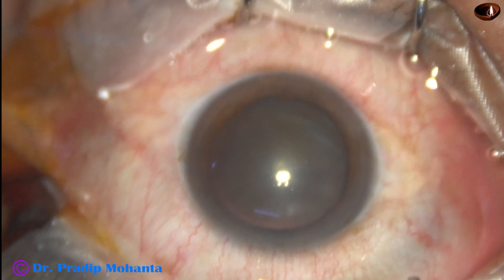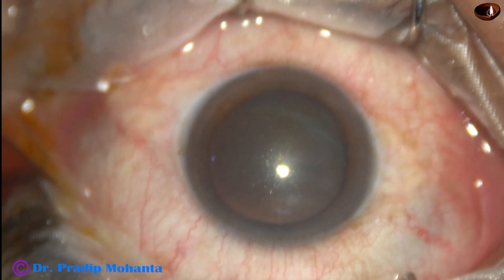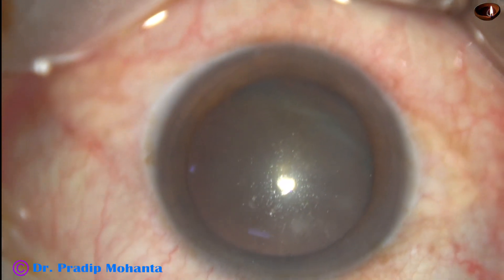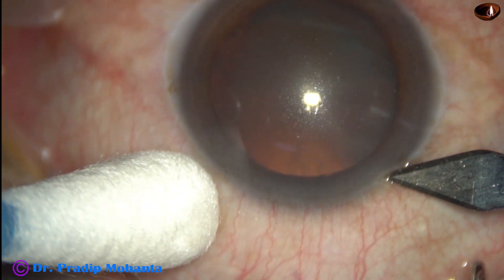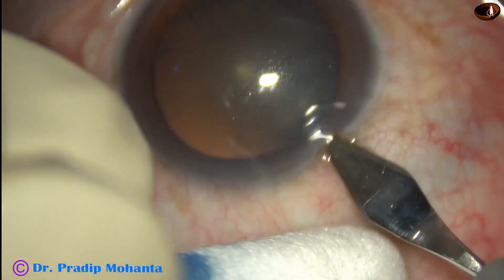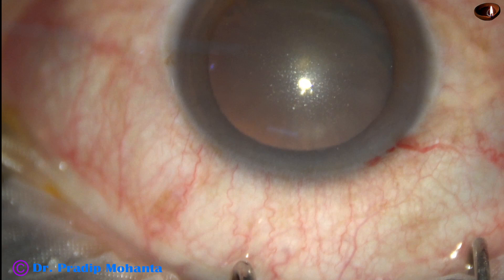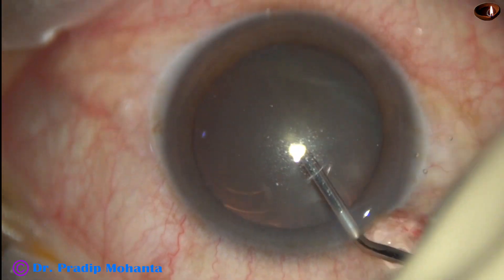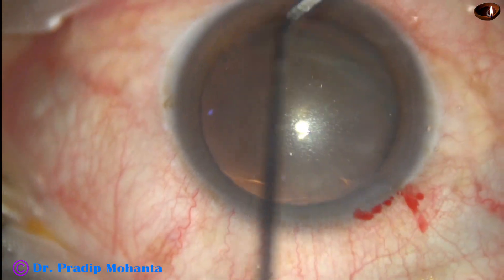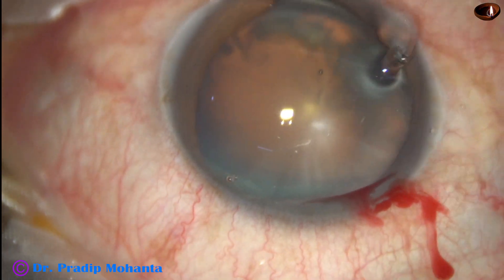The ocular surface is thoroughly irrigated after applying a few drops of 5% povidone iodine. Now this is the main incision with a 2.8 millimeter steel keratome at around 11 o'clock. The anterior chamber is filled up with 2% hydroxypropylmethylcellulose, which is also applied over the cornea for better visibility.